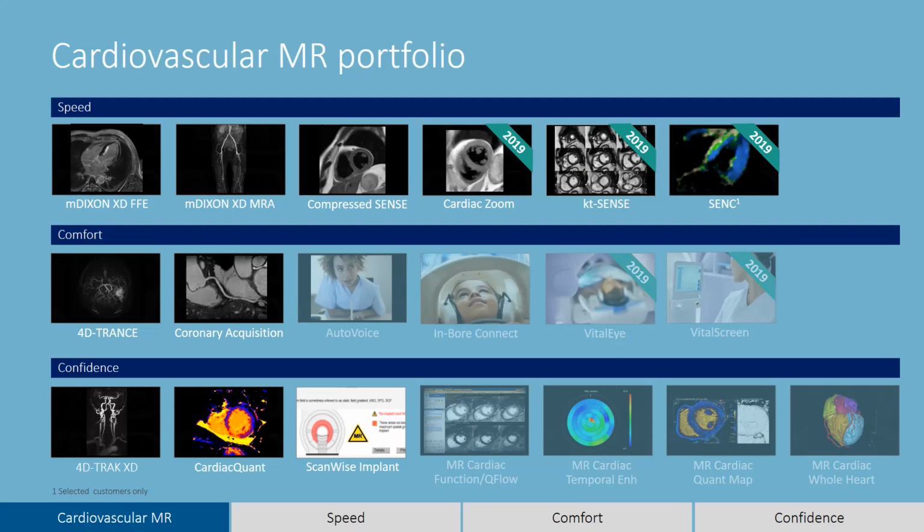This is why it's used in some signal modelization, or to get a good signal for the extracellular volume. So this parameter is very important to put in for some processing details. It's not equivalent to having an indication of the heart, because it's very different, but for the quantification and the optimization, it's very important to include this parameter.